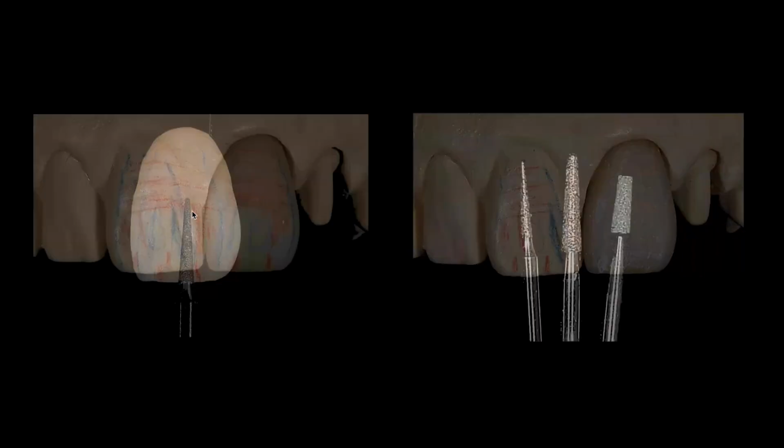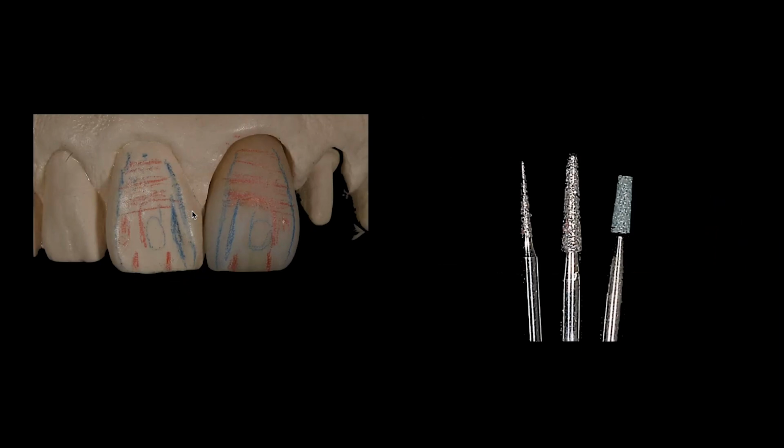What am I looking at? All the ridges, I'm looking at the heights, the grooves, the horizontals, the concavities and convexities, and I'm trying to map them all out so that when I come to my restoration, I can start to add some of them back in. And at this point, I really only use 3 or 4 different burs. Today, I'm a little more back and forth. I probably have about a dozen different ones that I'm using, and maybe always experimenting.